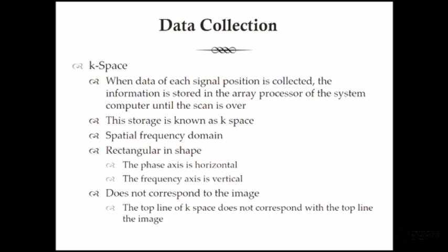To put it into terms, there are some spectroscopy imaging sequences where one run in a patient generates 1.9 gig of data. We need to collect all that 1.9 gig of data really rapidly, put it in an array processor, and then turn it into an image as close to real time as possible so that we're not waiting around to start the next scan.